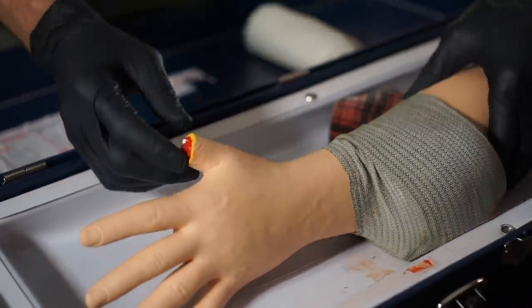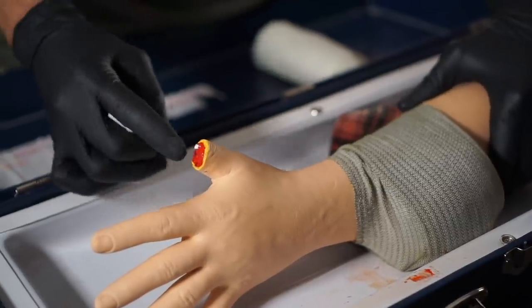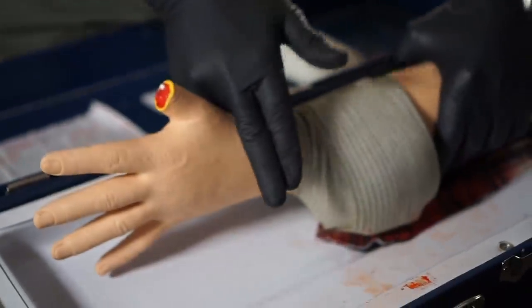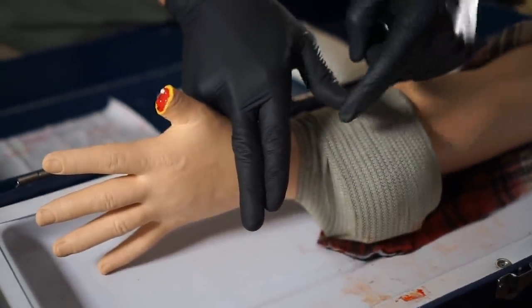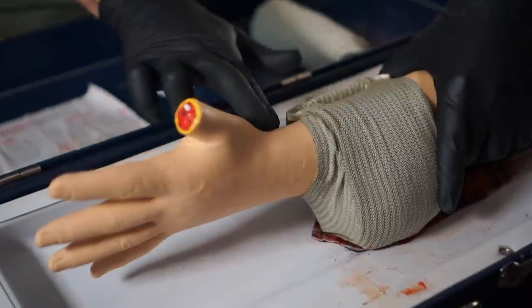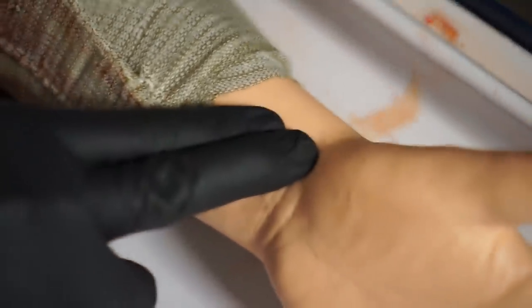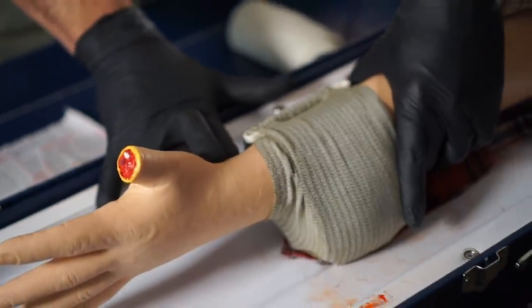When you're checking for the radial pulse, it's right here along the thumb on the inside — imagine this thumb is still here. Using two fingers, don't use your thumb because your thumb has its own pulse. Place two fingers right inside there and you should still be able to feel the pulse, which means you have not created the tourniquet effect. That's not what you're going for, so this is good to go.